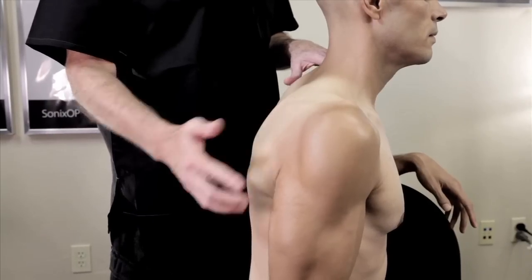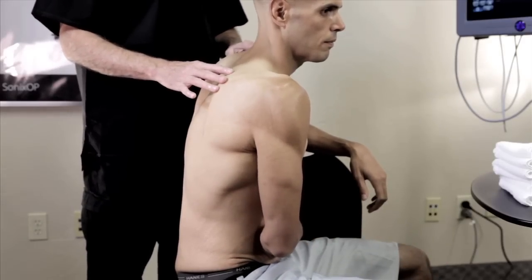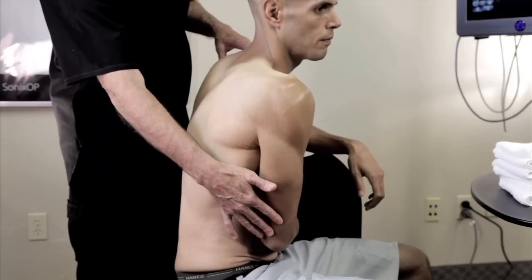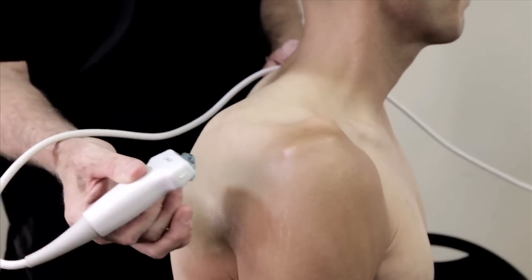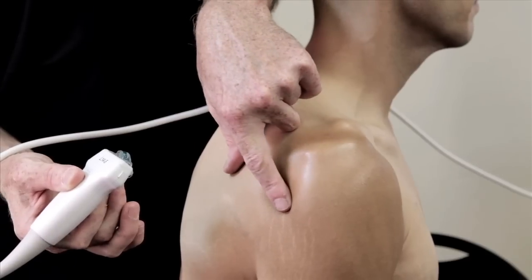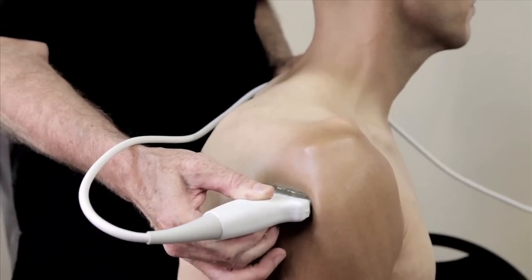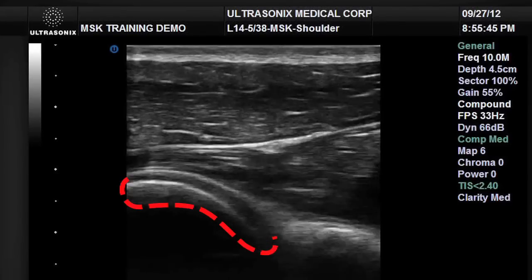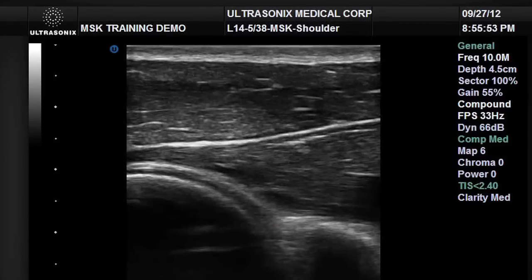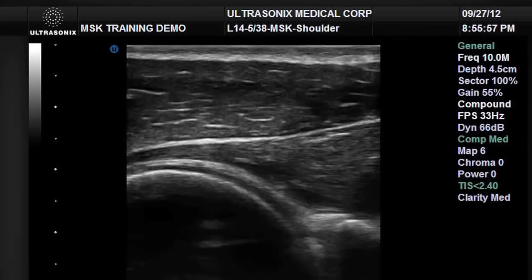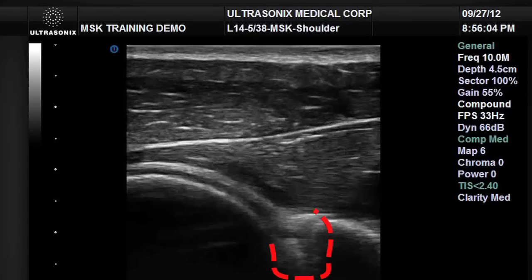To visualize the posterior glenohumeral joint, we ask the patient to internally rotate the arm and adduct tightly across the abdomen, grasping the opposing shoulder, with the elbow closely approximated to the side to open up the posterior joint space. Probe placement to visualize the posterior glenohumeral joint will be short axis, slightly oblique, and slightly distal from the scapular spine. On the image, the round convexity of the humeral head appears on the left, and the sharp apex of the glenoid appears on the right. Following the contour of the glenohumeral head is the capsule, and deep inside the articular margin between the humeral head and glenoid is a peripheral margin of the posterior glenoid labrum.